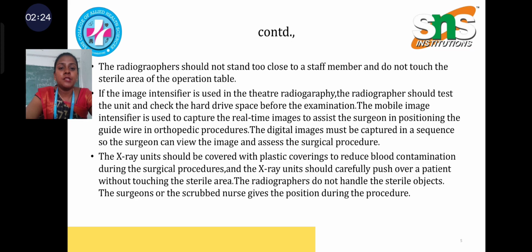The mobile image intensifier is used to capture the real-time images to assist the surgeon in positioning the guide wire in orthopedic procedures. The digital images must be captured in a sequence so the surgeon can view the image and assess the surgical procedure.